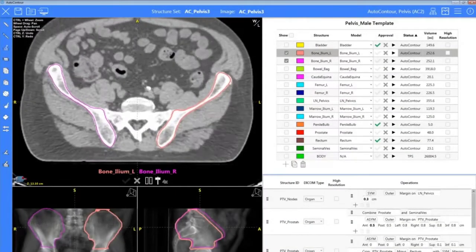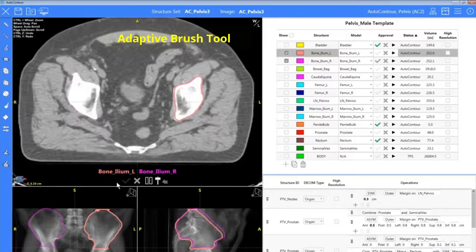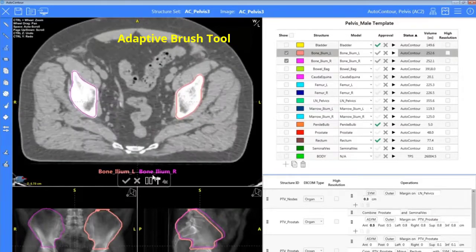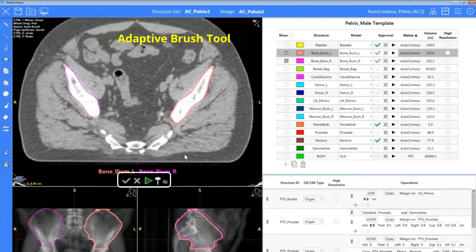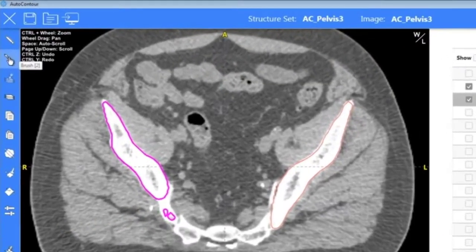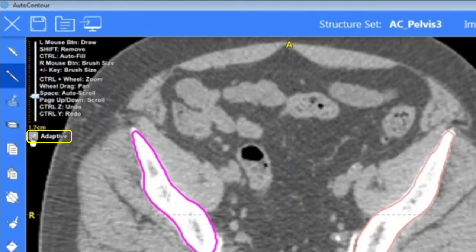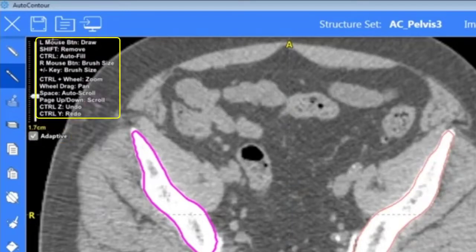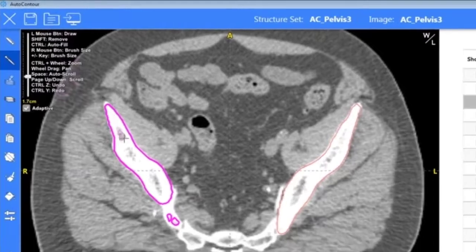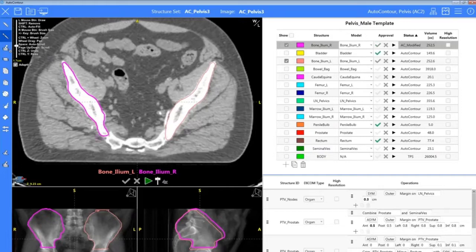Here's one of our newer models — the ilium bones — where I want to make a small adjustment. All we have to do is pause and then manually scroll to where we want to make changes. I want to fill this in with our adaptive brush, so I'll come over to the table, select my structure, and then select my tool. Here's where we can adjust that brush size and make it the adaptive tool. We have a list of shortcuts so you always know how to utilize your tools.